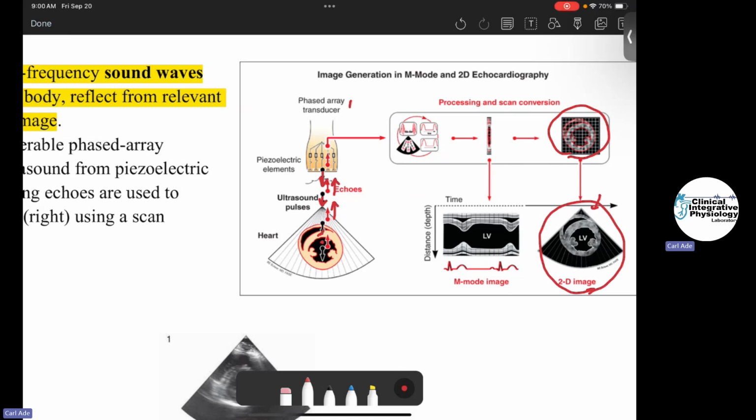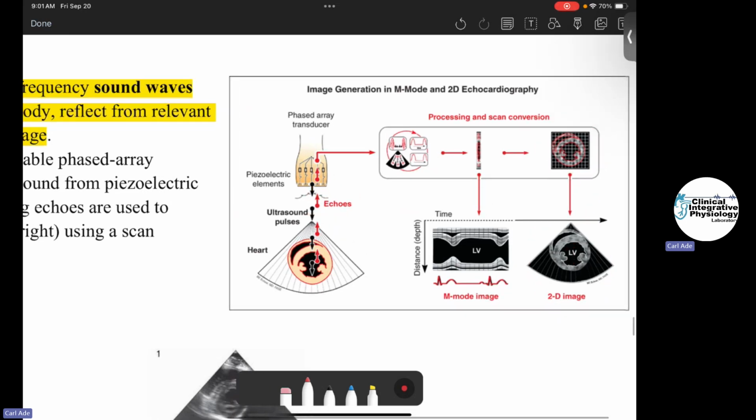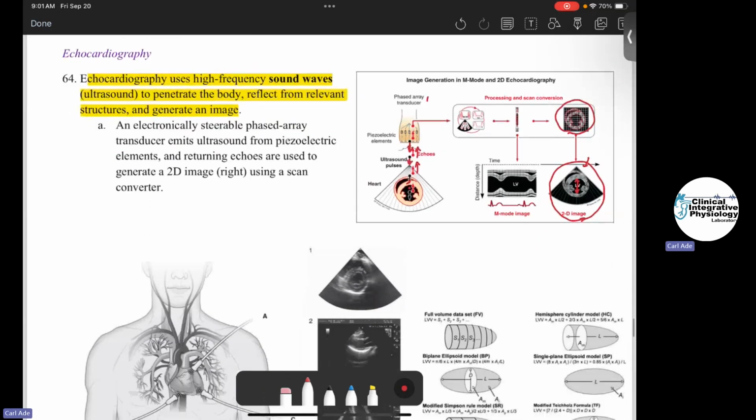And this is the left ventricle. This is a cross section, and so we're kind of looking down into it. You can imagine we could go in and assess chamber diameter. And what's really nice with the technology, we now have the ability to actually steer the sound waves and give us this really detailed information.